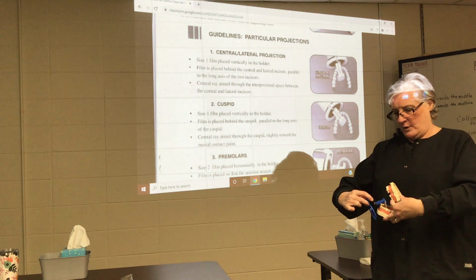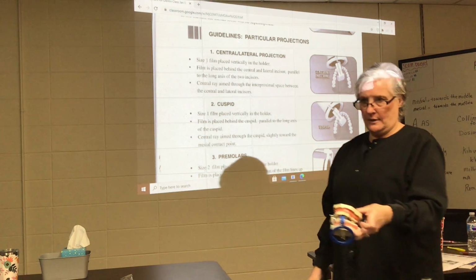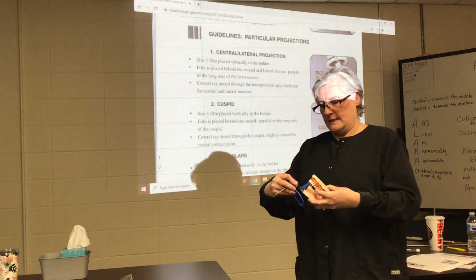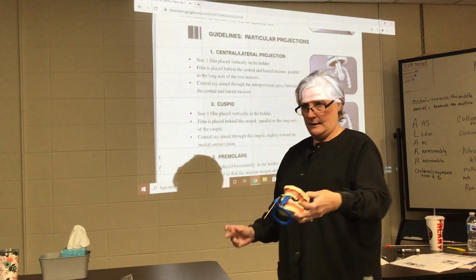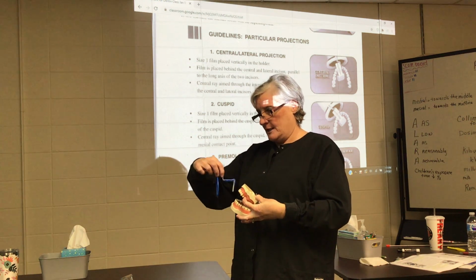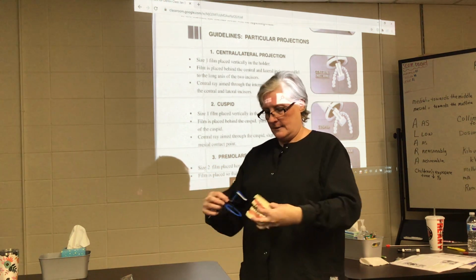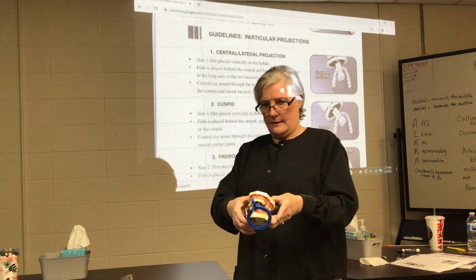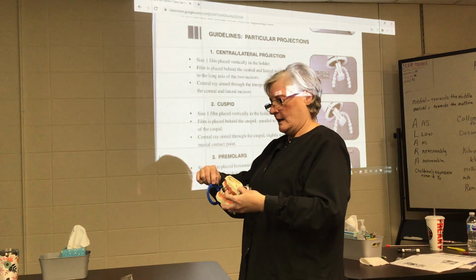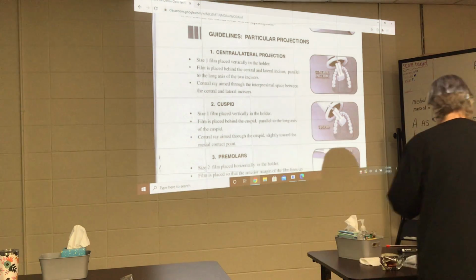And we're gonna come down here to 22 on the lower left, canine. We're gonna do canine lateral. Okay? We're gonna do canine, or centrals. And this, by the way, the film goes behind the tongue, not on top of the tongue. The tongue should be behind, on the back side of this. The tongue should be against that. Canine, or centrals, and then canine lateral.